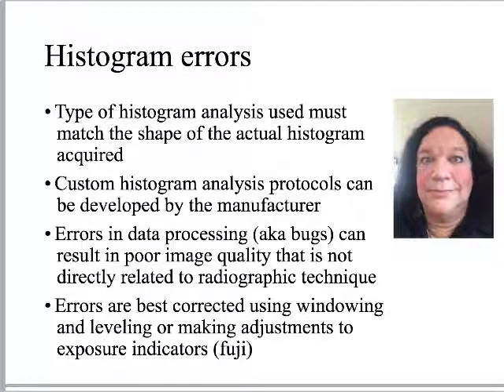You tracking with me? Have I lost anyone so far on this? So the way to fix it was not to change contrast and brightness. There was no way to window and level and make this pretty again. We had to go back and redefine the lookup table. If you go back and fix the lookup table, you'll get a good picture. Then you can window and level as you need to. You've got to change the whole makeup job. You've got to redo the foundation up.